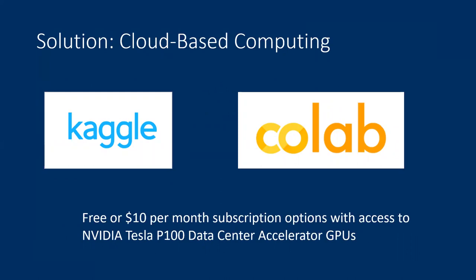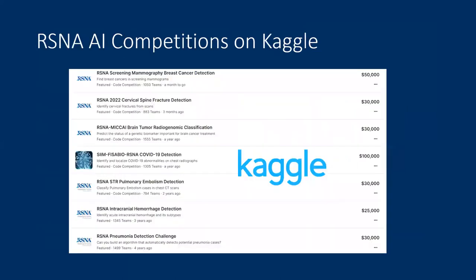These are not ideal solutions for projects using local clinical data, which might have specific HIPAA-related restrictions and would be a poor fit for using cloud-based GPU resources. However, these cloud-based resources are a great way to start out working with public data sets in order to learn more about radiology AI. Kaggle even hosts several competitions, including an annual RSNA challenge, which can be a great way to jump into relevant radiology AI projects and get a feel for state-of-the-art techniques.